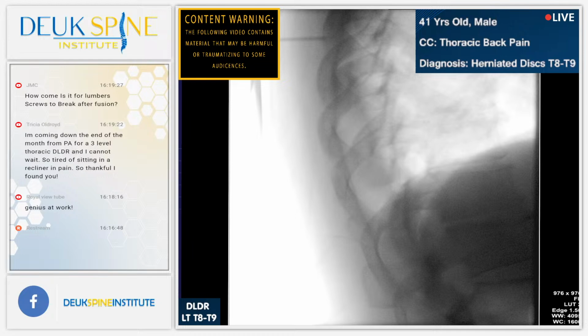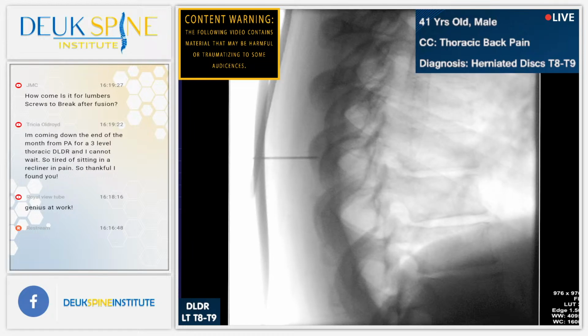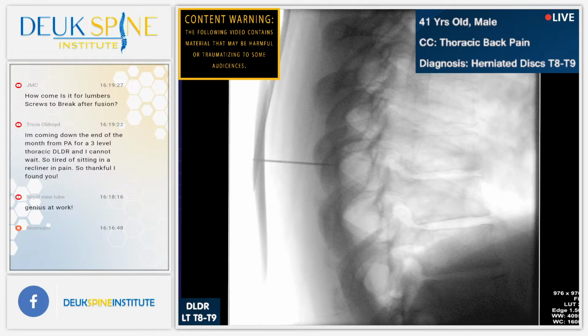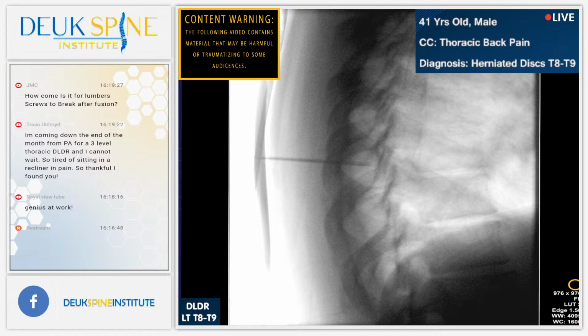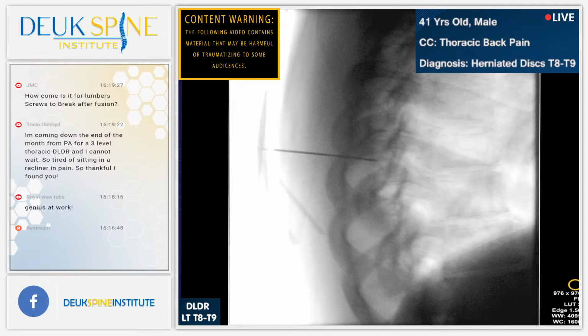Shot. All right. That looks pretty good. You're doing great. Lay still, okay? Shot. Now I got to make my way down to the T8-9 disc. Shot. Don't move. Keep your head still. He's not going to make it easy, is he?